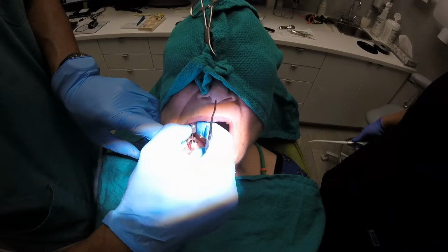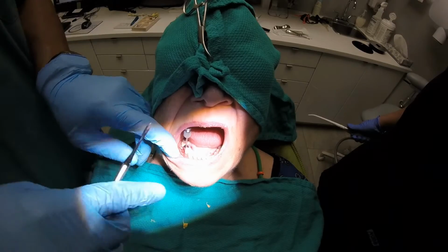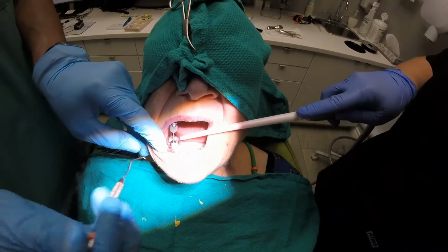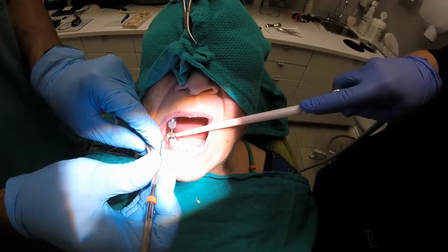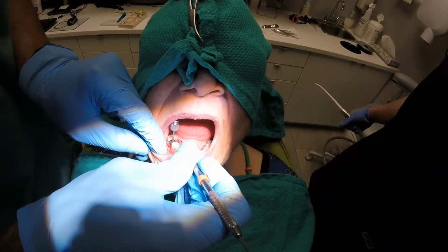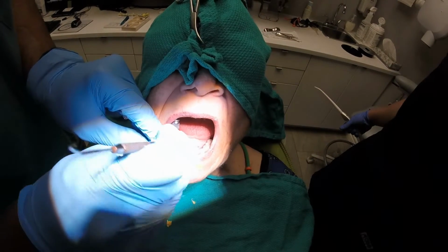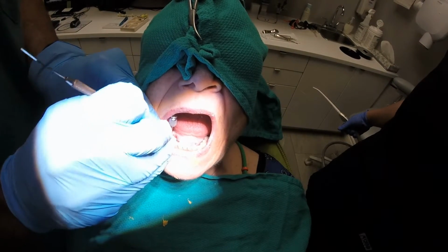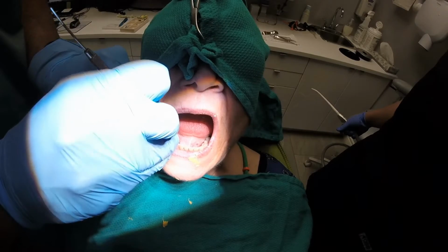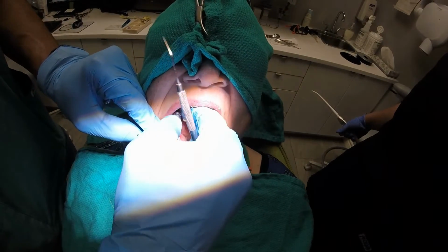So what I'm doing here, I've basically put the healing abutment down as best I can. I'm taking my Explorer just to sort of move those little H flaps of tissue out of the way so that we don't end up compressing them. And this is kind of like one of those gum graft things too. You're sort of changing the soft tissue biotype around the implant. So you're taking that nice, healthy, thick connective tissue and keratinized tissue and moving it to the side. What's going to happen? This is all going to heal beautifully around this healing abutment.